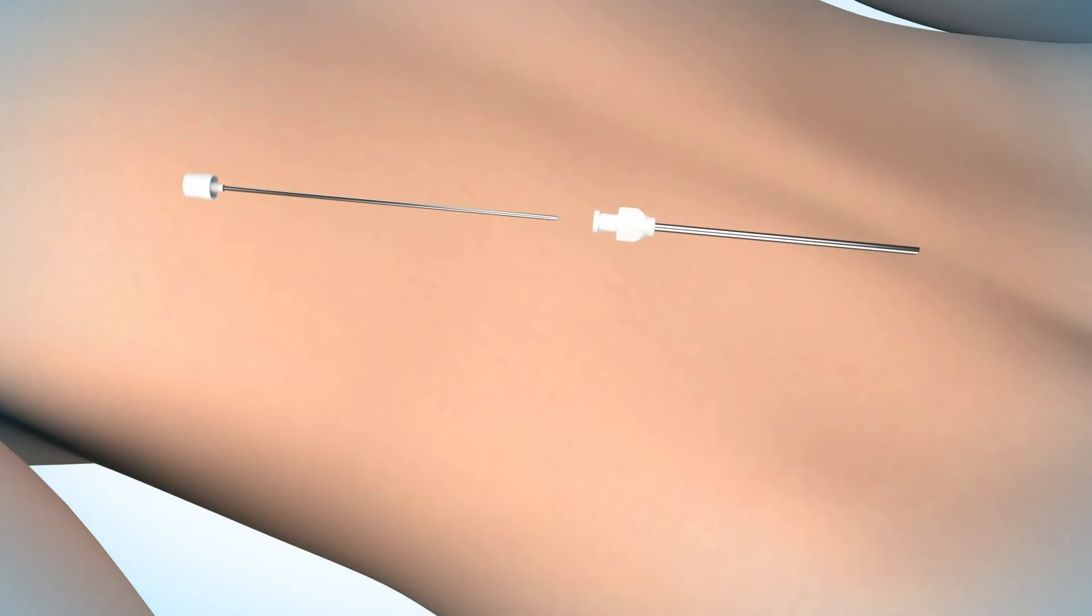With the patient prone, the disc to be treated is located using a posterolateral approach with a 17-gauge needle under fluoroscopic visualization.